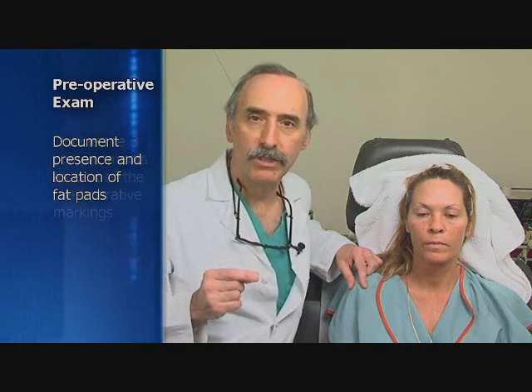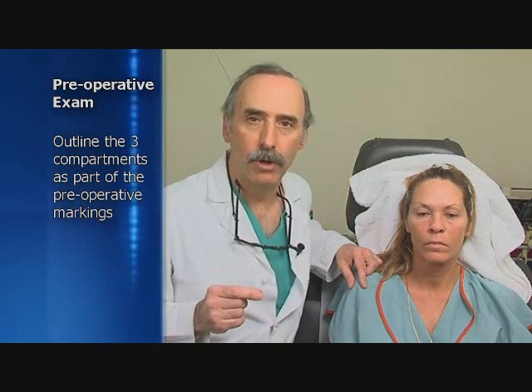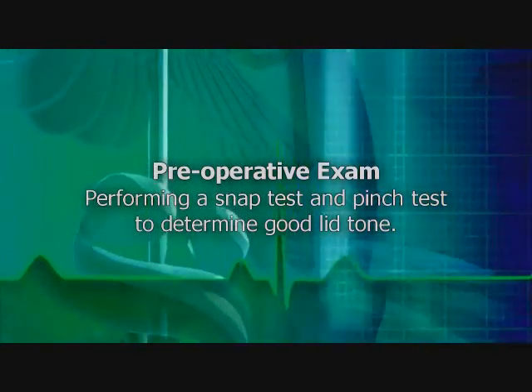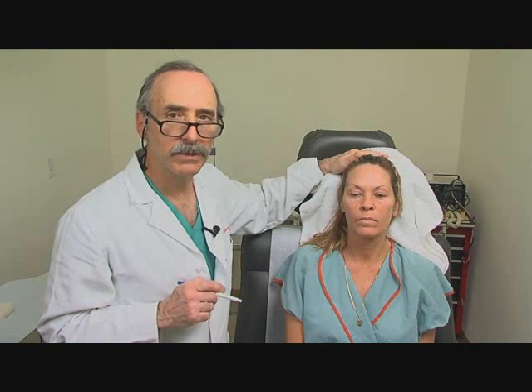While the fat pads are traditionally in 3 compartments, it's always worthwhile to outline those compartments as part of your preoperative marking. The physical examination for these patients is performed in the sitting position in order to document the snap test, the pinch test, and the location of the fat pads.